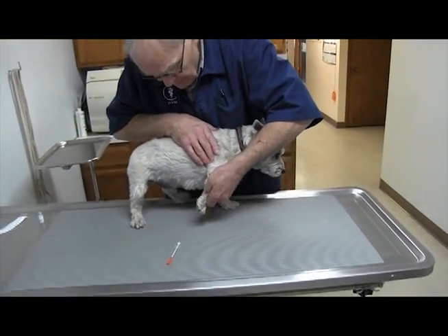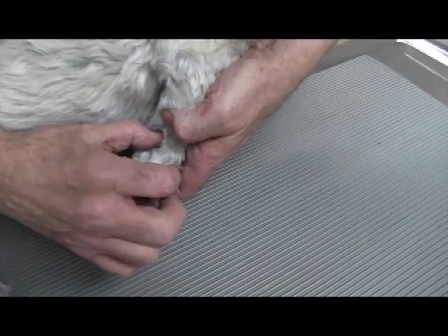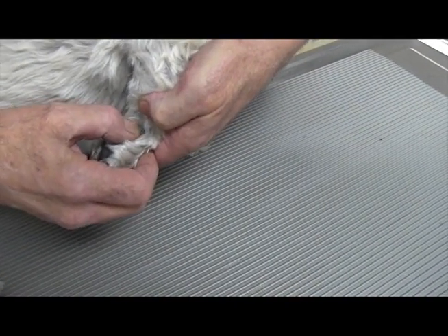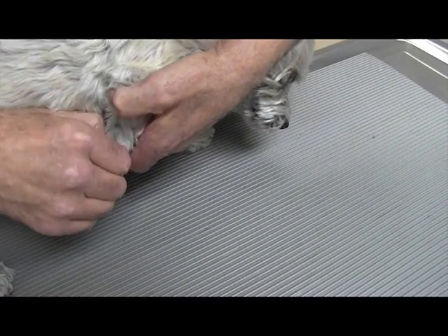Some folks will use this little bump right here above the paw — it's called the carpal pad. That's not really very sensitive, and sometimes they'll take a needle and poke that, and you can get enough blood for a test.